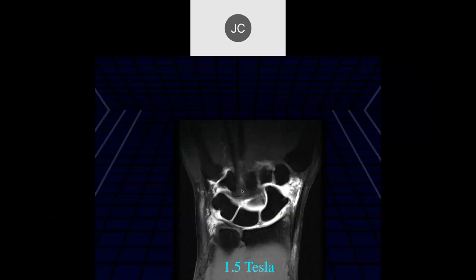Looking at the peripheral TFCC — it looks frayed, very frayed here — but notice we don't see the ulnar styloid. You have to be very concerned because it probably means it was imaged in supination, not pronation. You can get a lot of partial voluming artifacts in this situation.